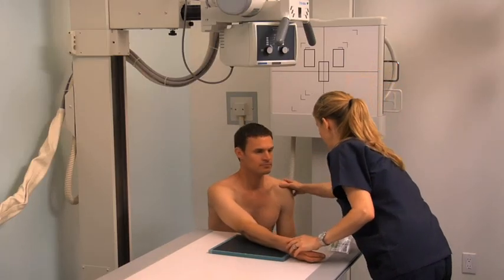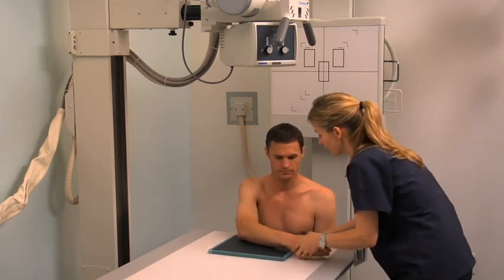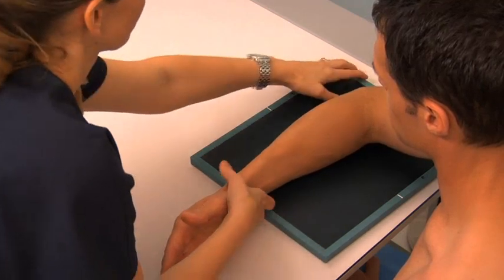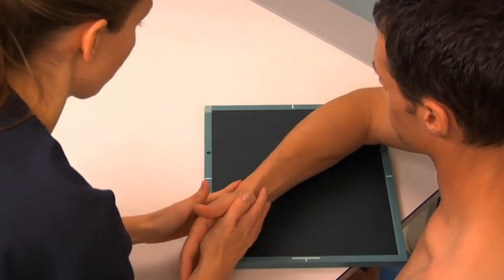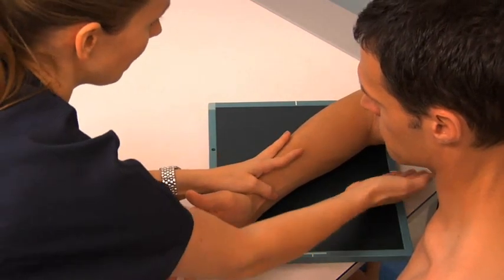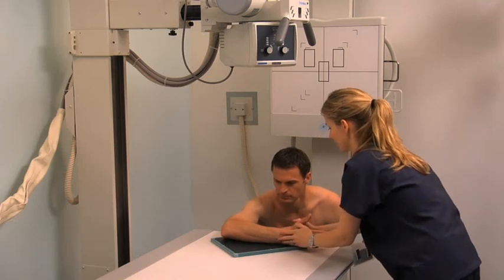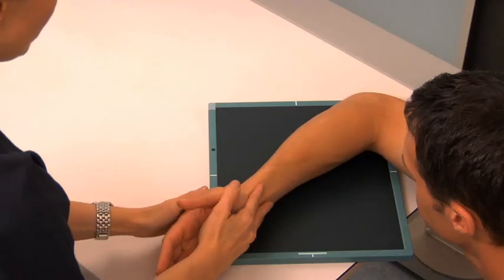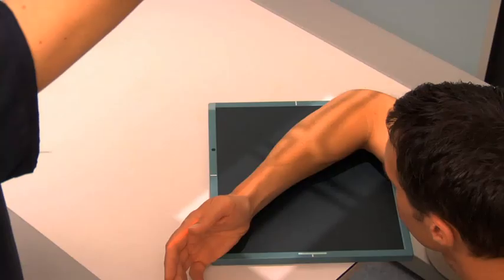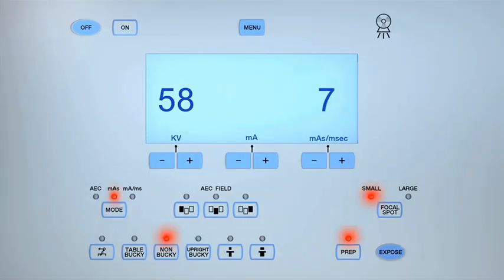Using another cassette, obtain a lateral projection of the forearm. Assist the patient to flex their elbow to an angle of 90 degrees. Align and center the forearm to the image receptor. Position the patient's forearm, wrist, and hand in the lateral position so that their thumb is uppermost. Palpate the humeral epicondyles and the radial and ulnar styloid processes to confirm superimposition. Collimate as for the AP projection of the forearm and expose the cassette.